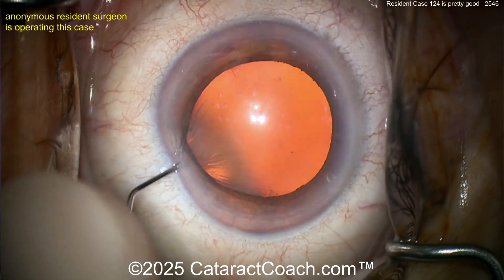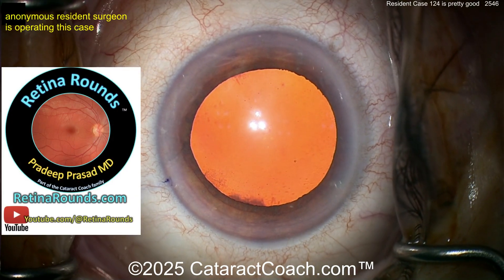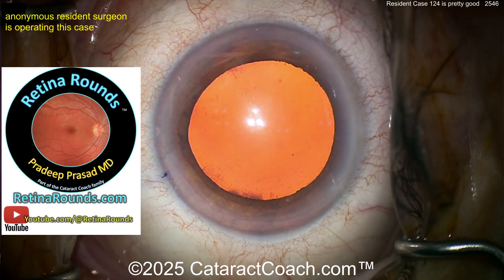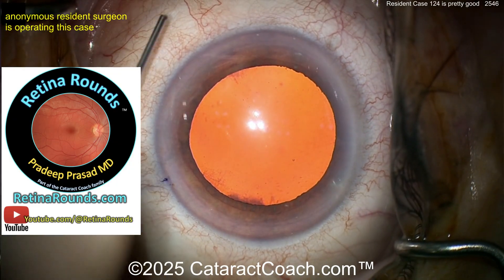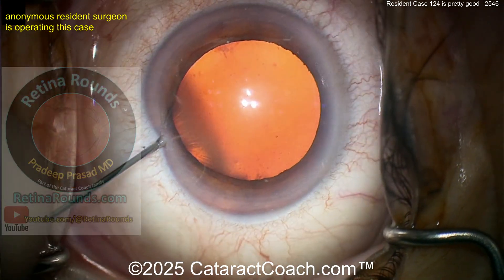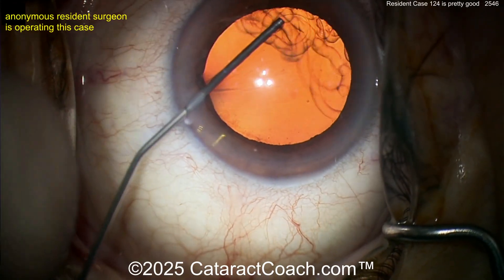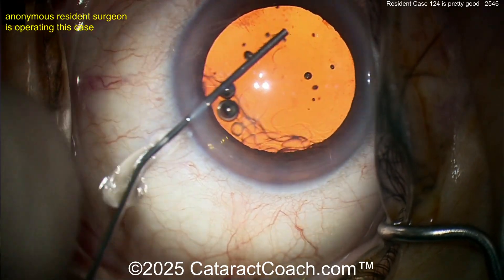Now going inside, probably some anesthetic. Notice how the eye is in primary — I like that. If you're a young surgeon or a resident, you should be signed up for RetinalRounds.com. It's material you need to know; it's going to teach you how to be a better ophthalmologist, even if you just do cataract surgery.